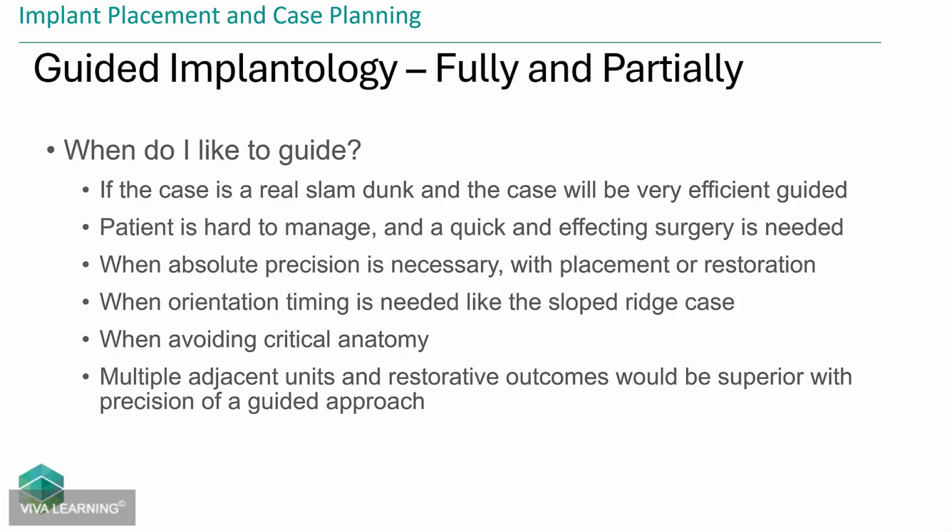And then there's cases where anatomy comes in, where you're squeezing a very narrow implant between two adjacent roots. You want to do all those guided, of course. And then when you're trying to avoid critical anatomy, you can guide or you can use drill stops like we talked about later. Other case that I think is very, very good for guides is when I'm doing 3 single unit implants side by side. I want to guide those so that we can precision put them where I'm going to get a good restoration, where I might put 3 good implants side by side, but 1 millimeter off 1-to-1 is going to create a bad restorative outcome.